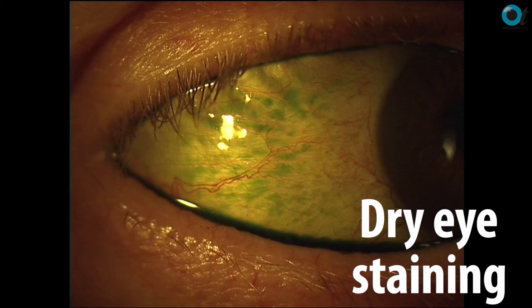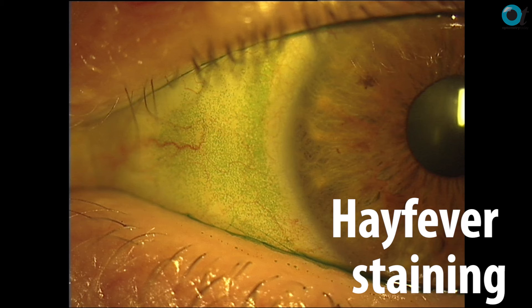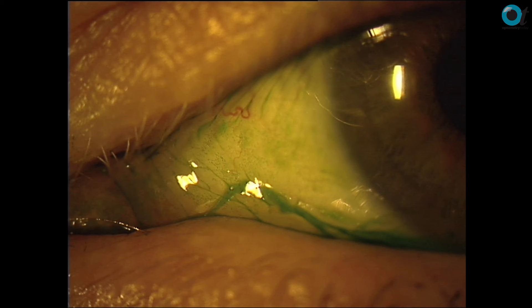This is a dry-eyed patient, but occasionally patients will tell you that their eyes itch. In hay fever season, how do you know if it's a dry eye itch or a hay fever itch? This is dry eye staining. This is hay fever staining. There's a big difference between these small tiny little stains with lissamine green and these larger areas with the conjunctival folds of dryness.